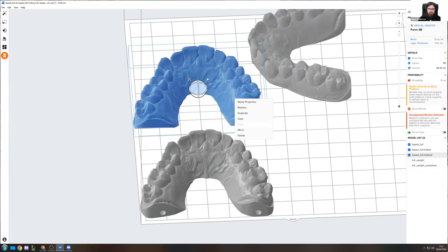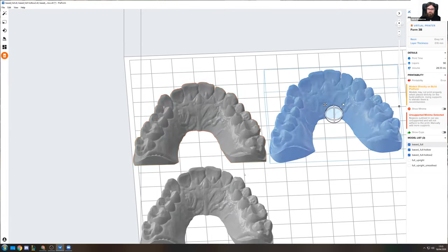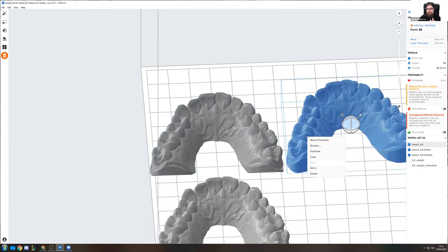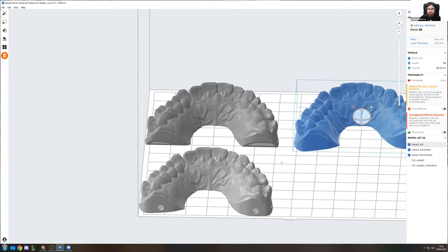And if you right click them, this is the exact same model right here. Let me just put them right next to each other so you can see. So this is the exact same model. This left one is just hollowed out. And if we right click on a model and go to model properties, we can see how much resin this takes. So this takes around about 6.5 milliliters of resin right here. And the full arch, which I haven't hollowed out, takes around about 15.25 milliliters of resin. So this is less than half of the resin that we would be using in this type of case. And this is something that we recommend to get the most value out of the resins.